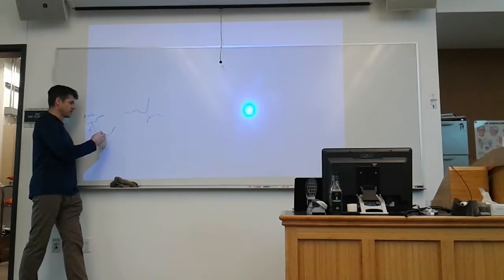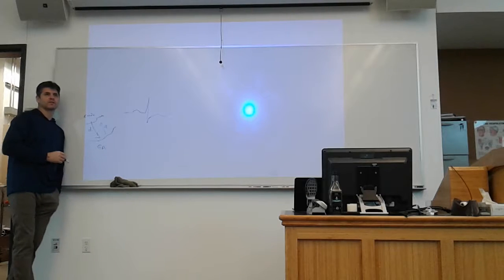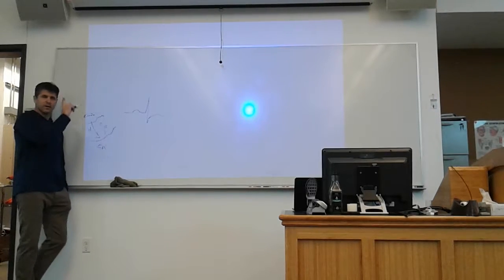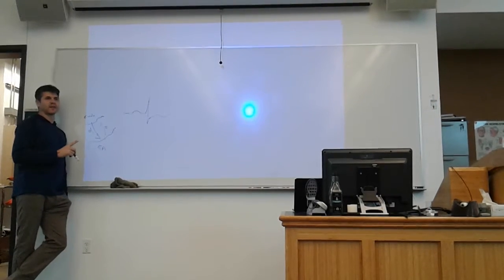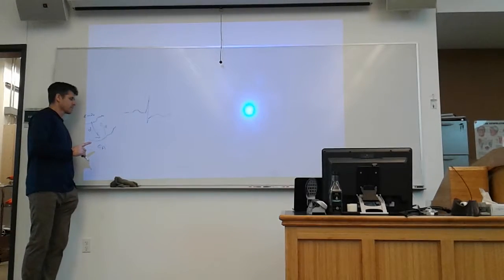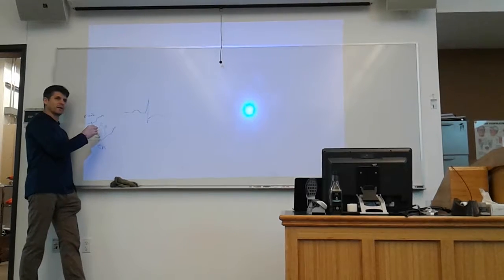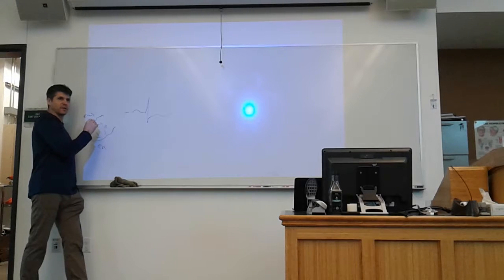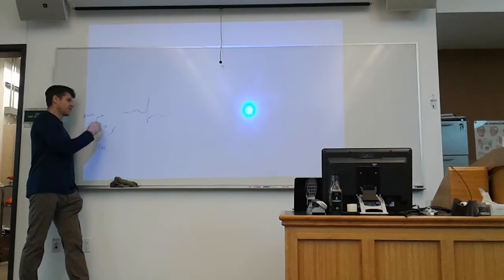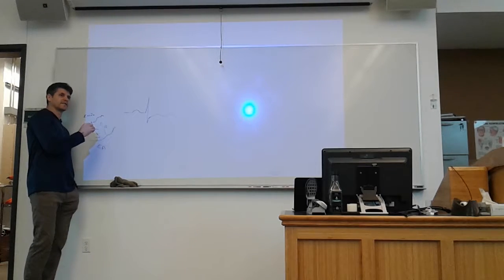And the typical repolarization is the other direction, right? That's our typical repolarization process. Now we have a couple of things that are going to come into play that make this more difficult. One is that we have some issues where we start to have ischemia. This directional repolarization system doesn't work as much.